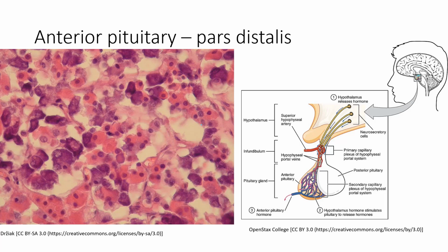The pars distalis is the main body of the anterior pituitary gland, and it contains three cell types. The first, I'll outline this one kind of, is blue good? I think blue will work. There's one down here. I feel like there was one right up in here. These little guys are called chromophobes.